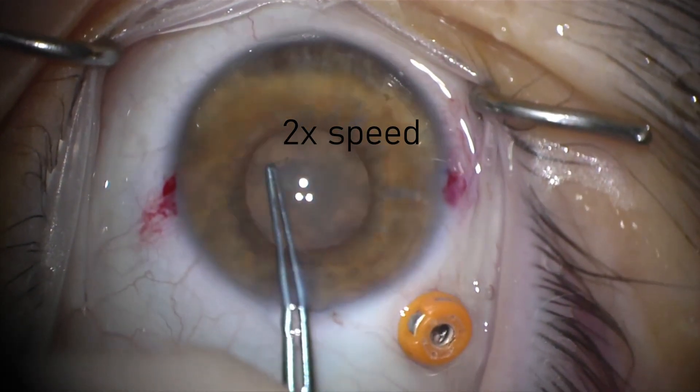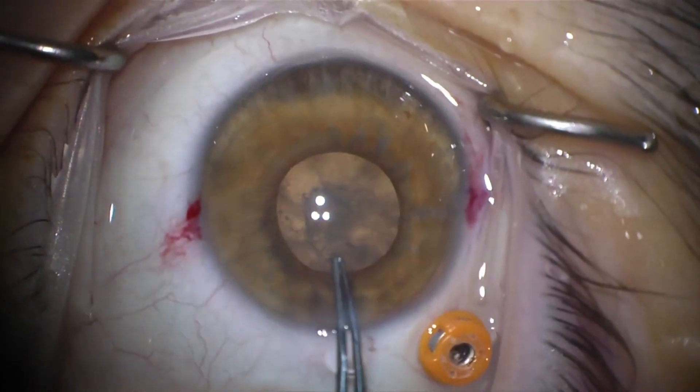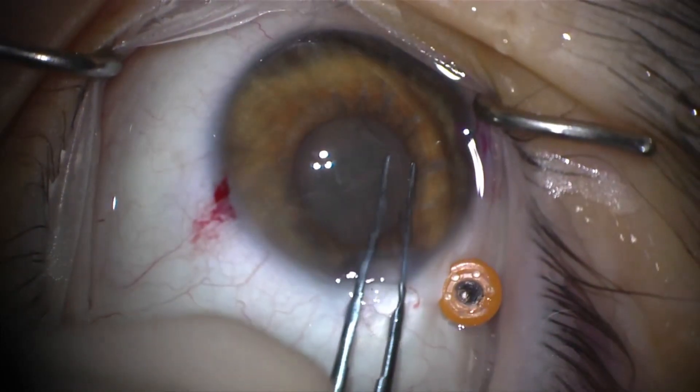Here the capsulorhexis is initiated. It's slightly difficult due to hypotony. We manage to get the flap up and create a rhexis slightly larger than the pupil.